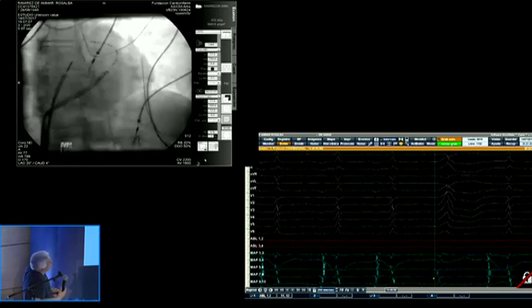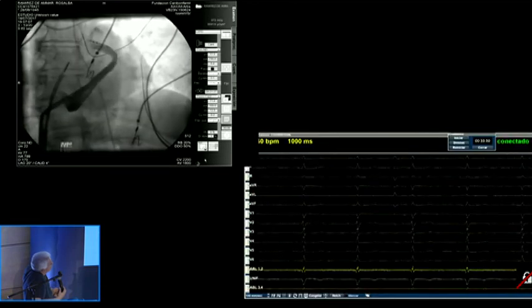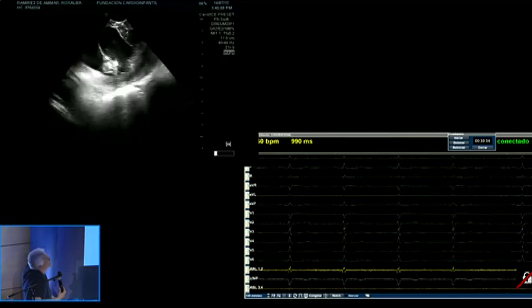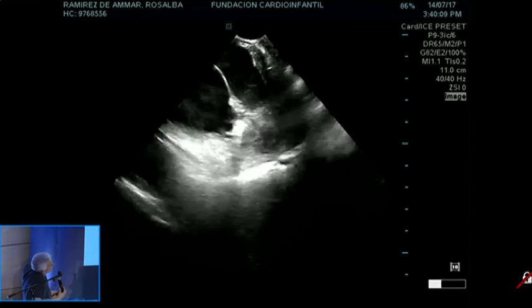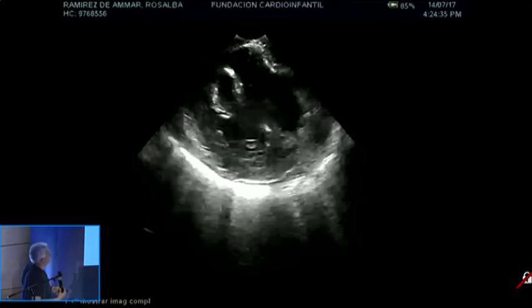Live, please. We need it live, real time. So Diego is going to handle the catheter. ¿Nos pueden poner la pantalla de eco intracardíaco, por favor? Can we see the ICE screen, please? Tiempo real. En grande. Real time, and we want the large screen. Okay, counter. Diego, start from the posterior aspect. Diego, empiece de la cara posterior del ventrículo izquierdo.